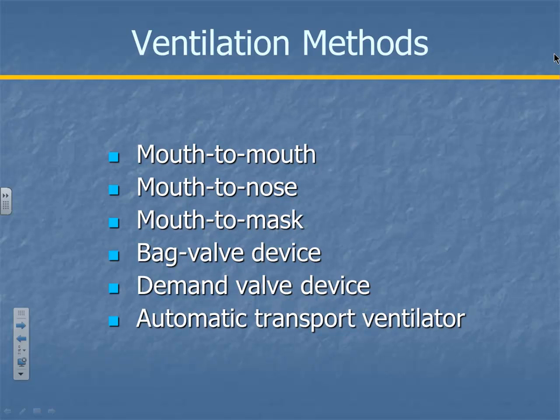Because you can feel when you get pressure, you're not over-ventilating. Exactly. When you're blowing in there, number one, you can't blow more than you can exhale, which is going to be limited. If I've got both hands on that bag, I can put 1,500 to 1,600 cc's in there. If I'm blowing in here, I'm probably not going to be able to blow more than 700 or 800. Who knows? I don't know how much.